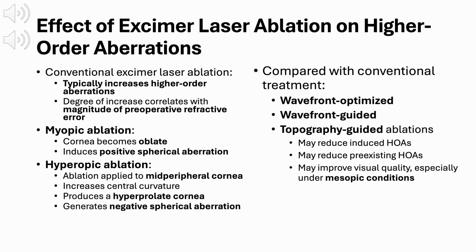Wavefront optimized, wavefront guided, and topography guided ablations are designed to better control higher order aberrations. These techniques may reduce the amount of surgically induced HOAs, may reduce pre-existing aberrations, and can improve overall visual quality, particularly under mesopic conditions when the pupil is larger. The key takeaway is that excimer laser ablation doesn't just change refraction, it reshapes the optical system in ways that directly influence higher-order aberrations, and newer customization strategies aim to minimize those unintended effects.